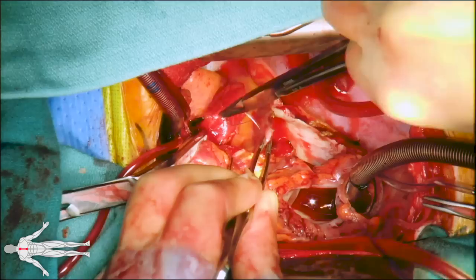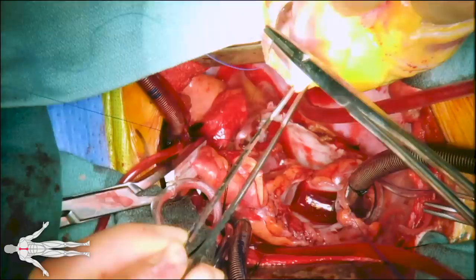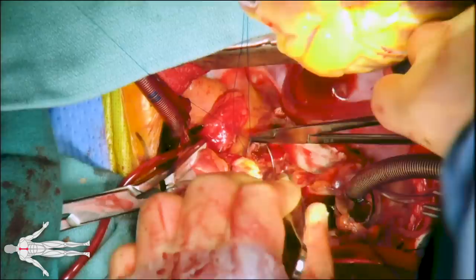An anastomosis is constructed between the recipient's and donor's left atrium using a 3-0 Prolene suture in a running fashion.